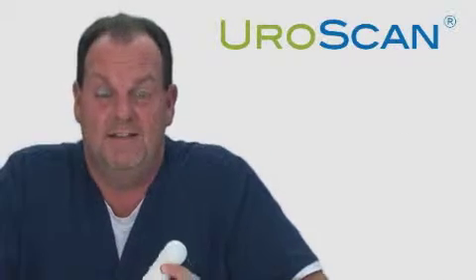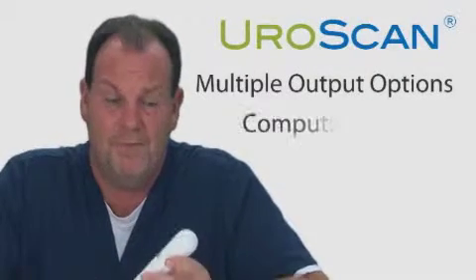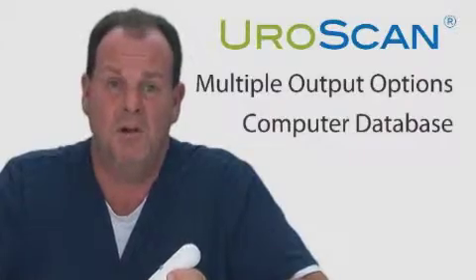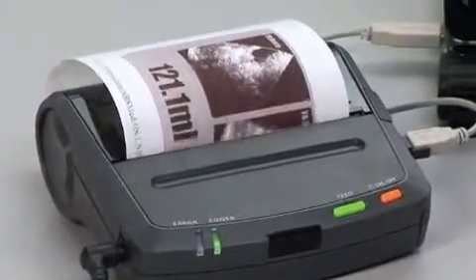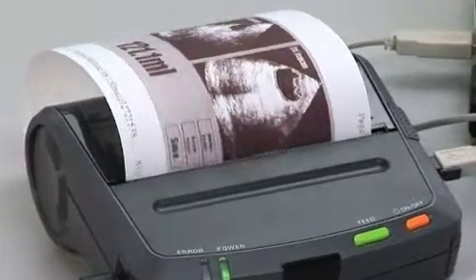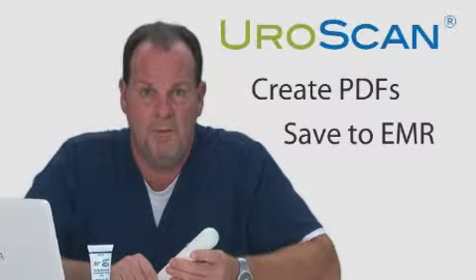The UroScan has lots of output options, giving you lots of options for saving your information. First, the image is saved to the hard drive of the computer. Second, you can print your report, giving you a piece of paper for the patient chart. Third, you can save it electronically, either as a PDF or directly into your EMR.